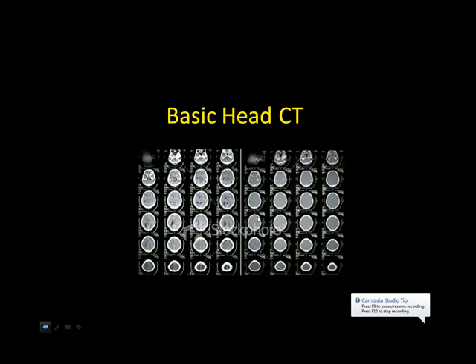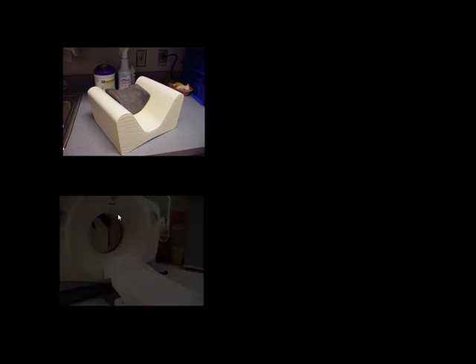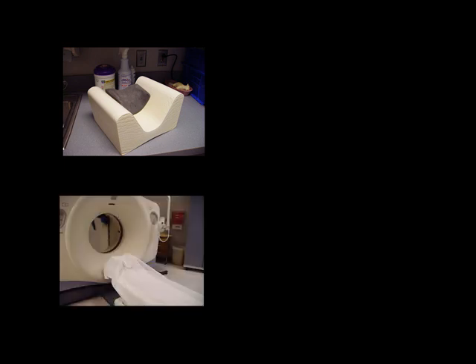The first part of this week's lesson is on a basic head CT. Now in the CT room, you may see a positioning pillow like this, and it's positioned on the table with a sheet over it.